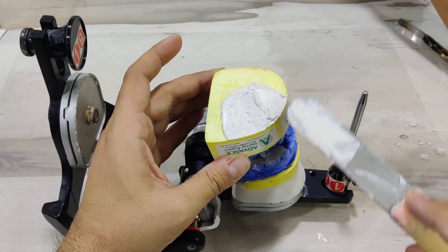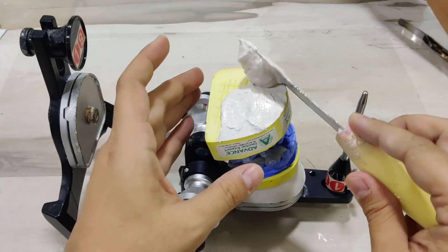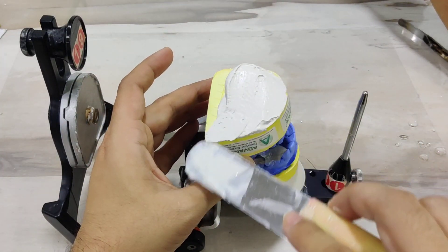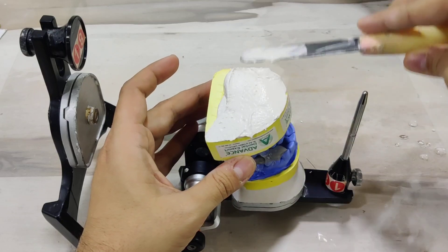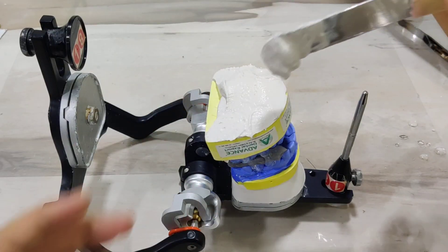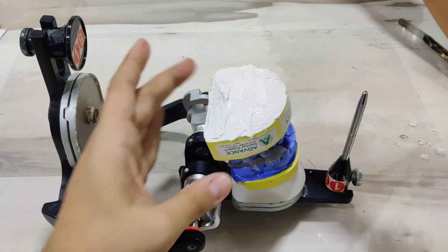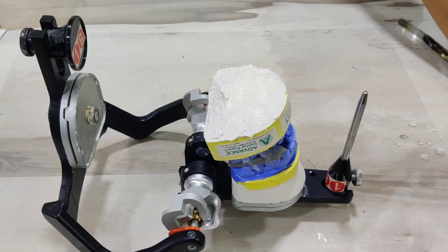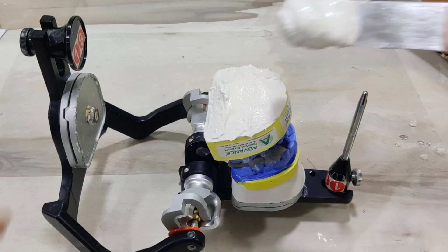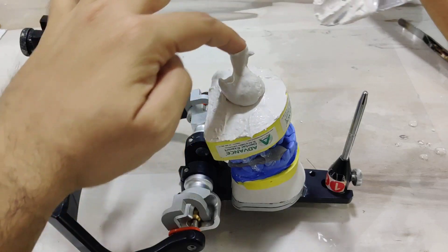The first thing, like we did for the maxillary arch, we go ahead and adapt it to the cast, making sure that we get through all the edges and keep a small tower in the middle. We've covered the entire cast and I'm going to go ahead and keep a small piece of plaster in the center.